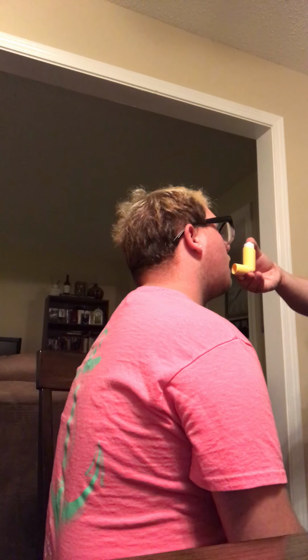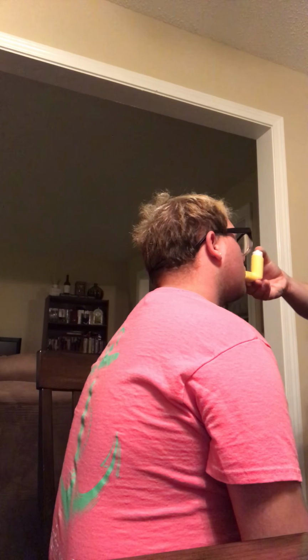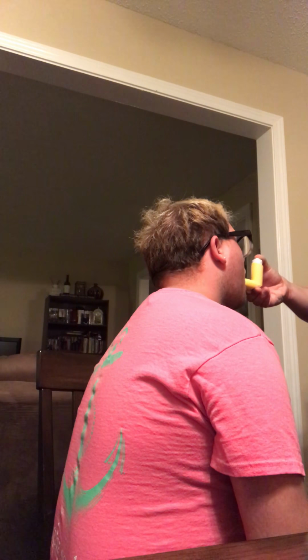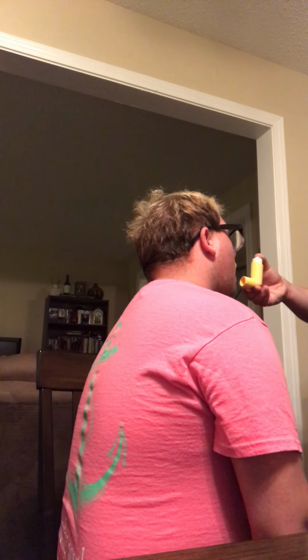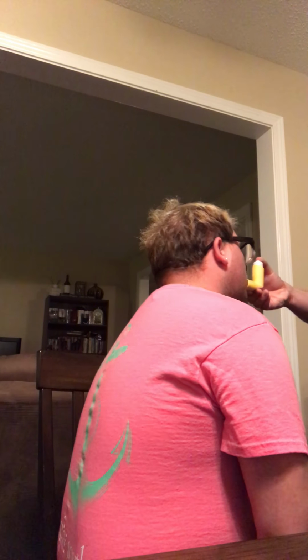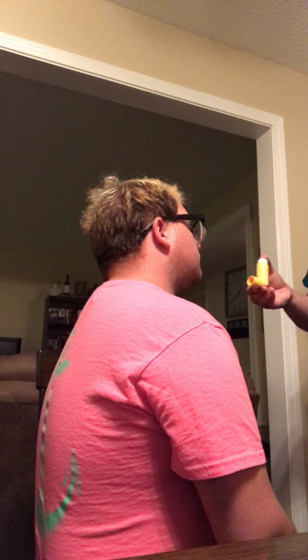Alright, I'm going to go ahead and we're going to give you a puff, okay? Open your mouth real wide for me. I want you to actually take a deep breath and exhale first. And then hold it, and then we're going to wait a minute in between.